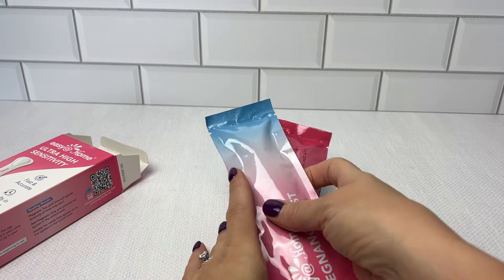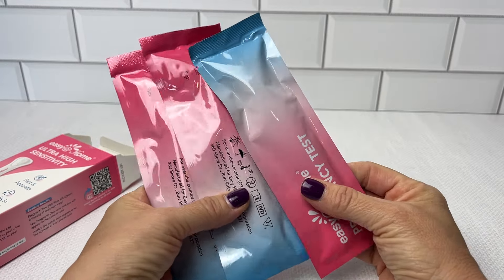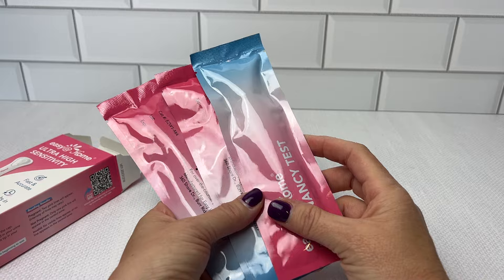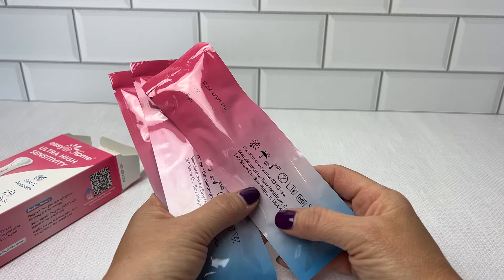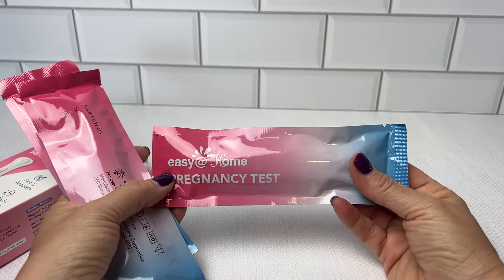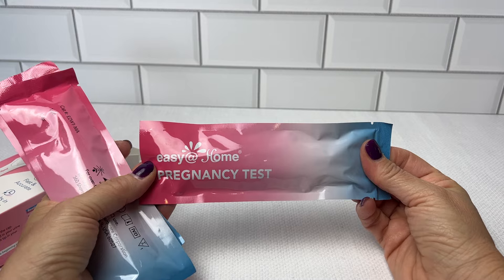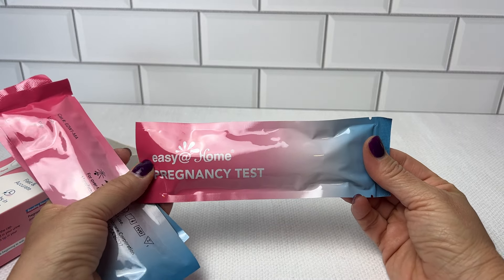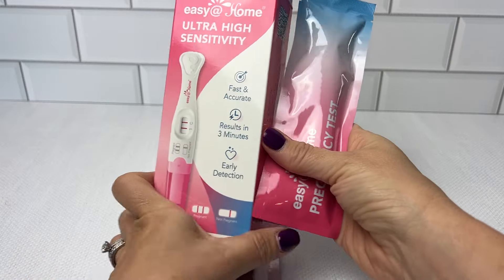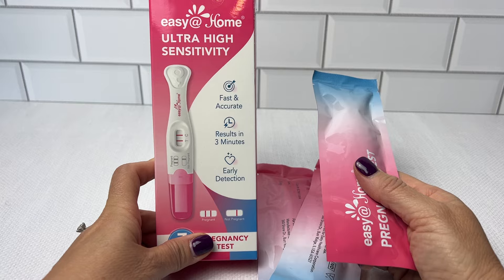There are three tests in each box. Let's talk convenience. Each test stick is individually sealed, as you can see — perfect for those moments when you need to discreetly check your status, whether you're at home or on the go. Gone are the days of fumbling with testing cups. You have this easy-to-hold handle, making this process a real breeze.